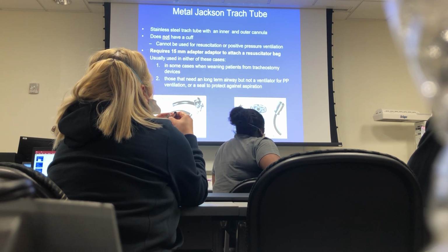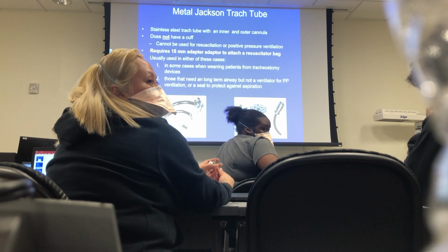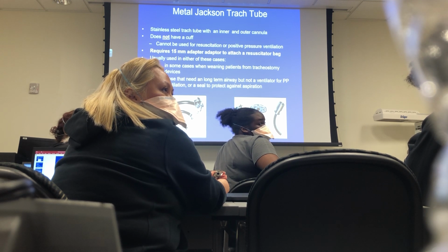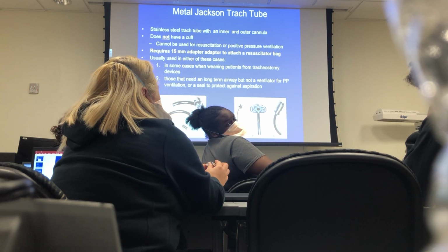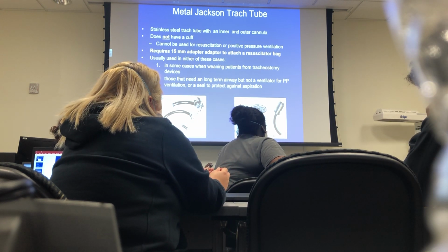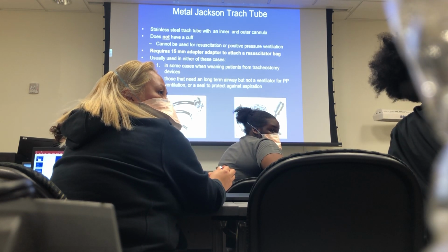So they have obturators, okay, in other words, when the trach is put in, the inner cannula is not in there, the obturator goes in. So it slides into the space, okay? Inner cannula goes in, and it stays in, okay? Now the inner cannula, it gets washed. They have trach care kits that have little brushes and peroxide in them. You mix equal parts peroxide and sterile water.